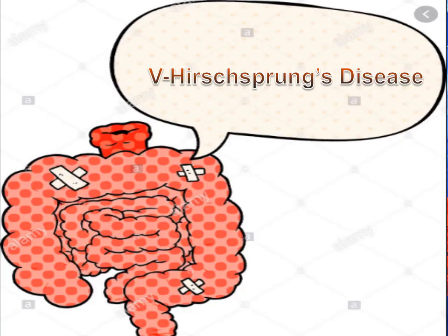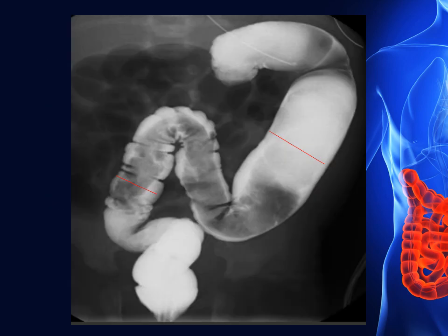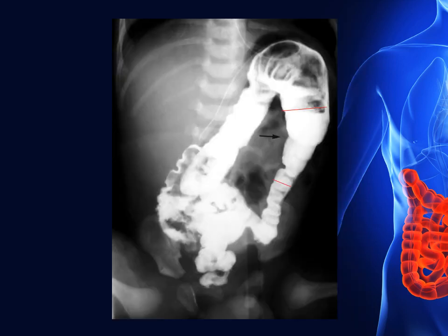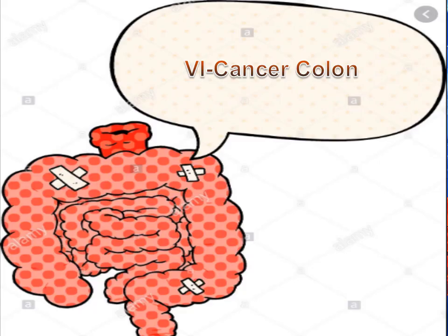Hirschsprung's disease is the most common cause of neonatal colonic obstruction. It is commonly characterized by a short segment of colonic aganglionosis affecting neonates. The affected segment is of small caliber with proximal dilatation. Fasciculation or sawtooth irregularity of the affected segment is frequently seen, and a transition zone is visible. You can recognize the difference in caliber between the normal and affected segments.